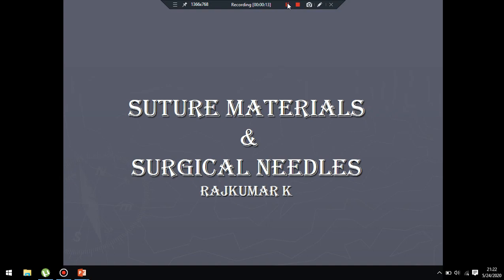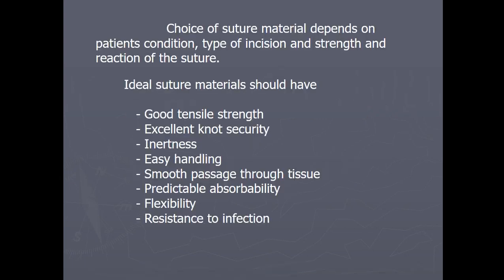Today's topic is suture materials and needles. The ideal suture material: in any topic, if it is mentioning ideal, then there is no ideal material or ideal procedure available.